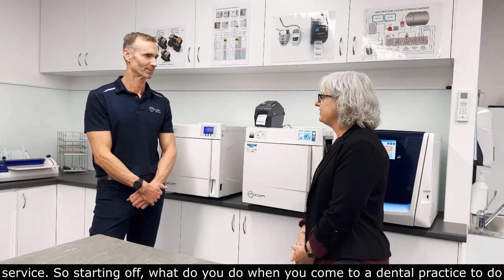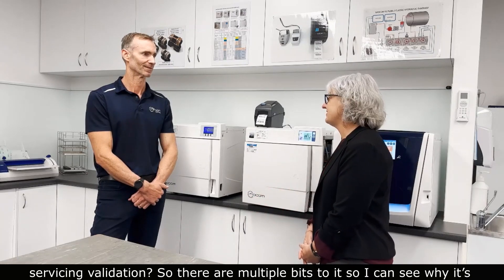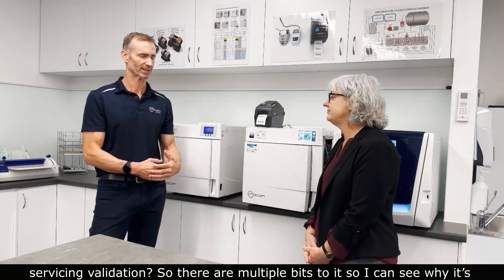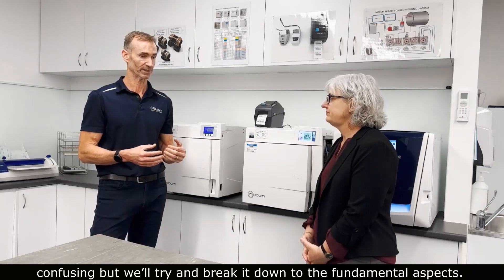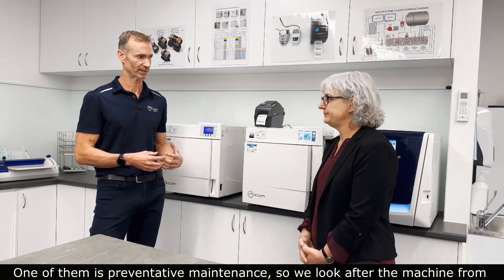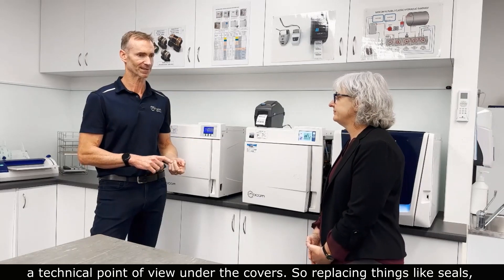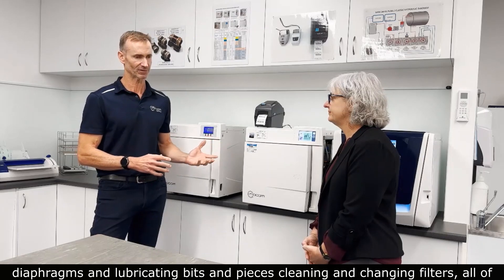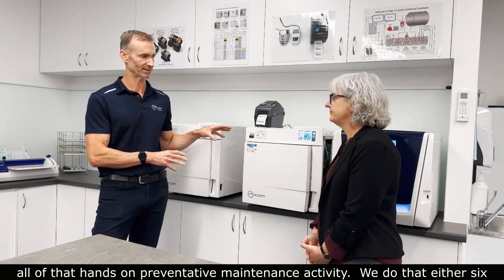So starting off, what do you do when you come to a dental practice to do servicing and validation? There are kind of multiple bits to it and I can see why it's confusing, but we'll try and break it down into the fundamental aspects. One of them is preventative maintenance, so we look after the machine from a technical point of view — under the covers — replacing things like seals and diaphragms, lubricating bits, cleaning, and changing filters.